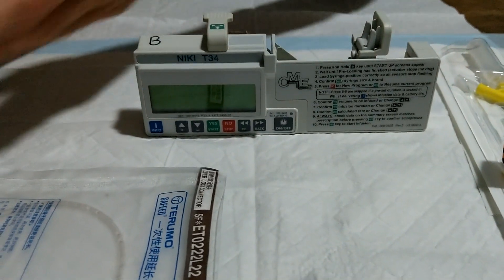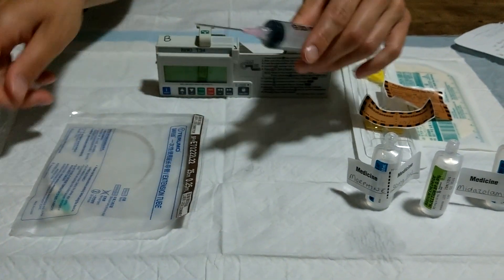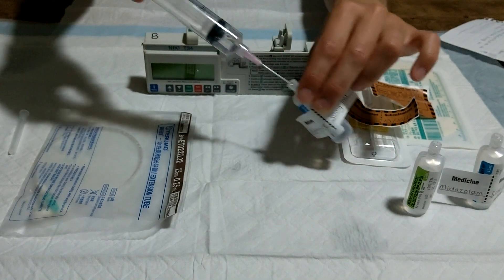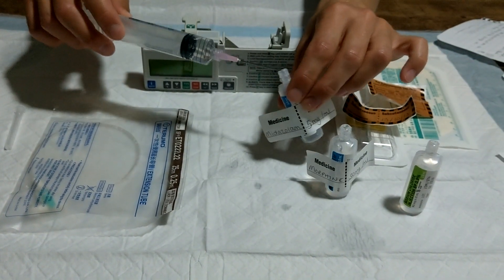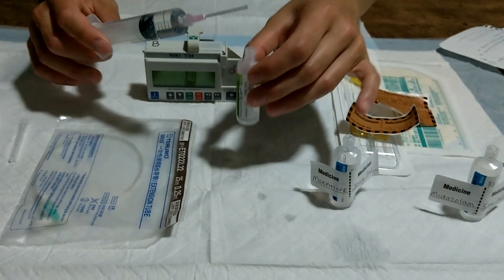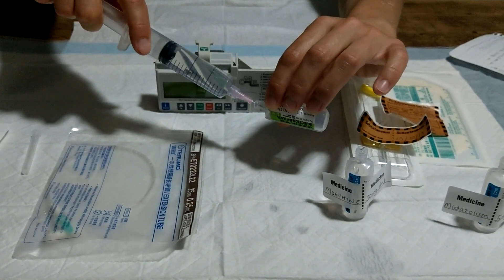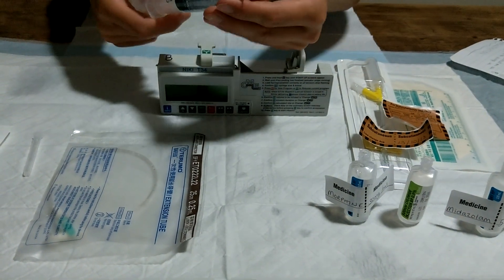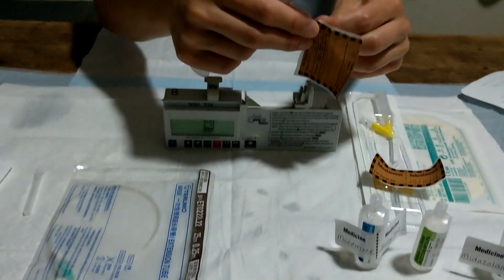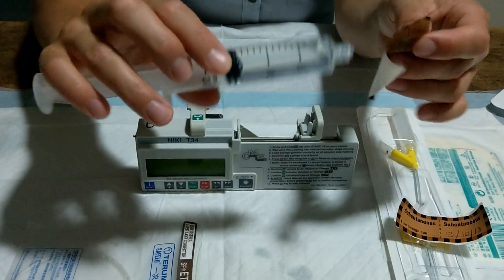Stage one: draw up the medications. Use your drawing up needle. Queensland policy states that we put the medications in a 20 mL syringe because it dilutes the medications and reduces inflammation at the site of injection. We mix with normal saline. Anything between 15 and 16 mL and the machine will actually calculate your rate for you. Discard your sharps and add your label, bearing in mind you need to keep the numbers still visible.